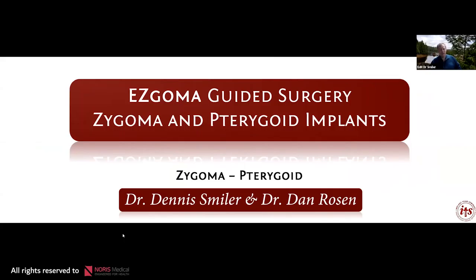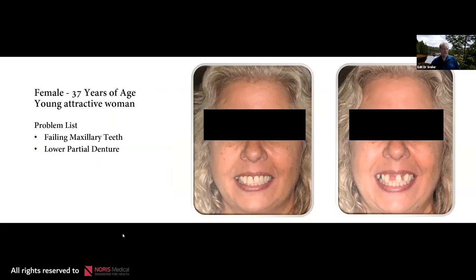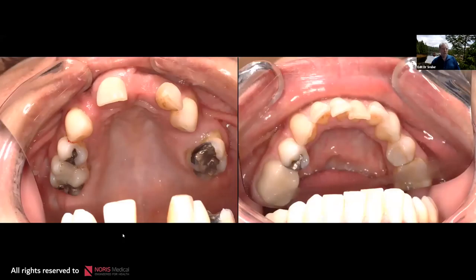Using Easy Goma guided surgery for zygoma and pterygoid implants: this patient is 37 years old, an attractive woman with failing maxillary teeth and a partial denture prosthesis. There is a somewhat hyperplastic area of alveolar bone — a large amount of alveolar bone. What's interesting about this case is that the Easy Goma guide will show us how much bone we need to remove on the alveolus in order to place the implants.